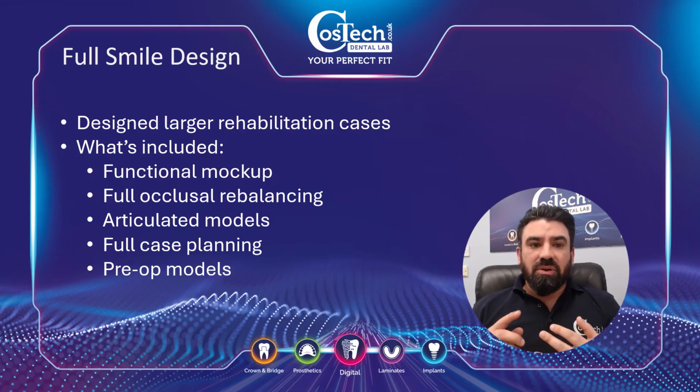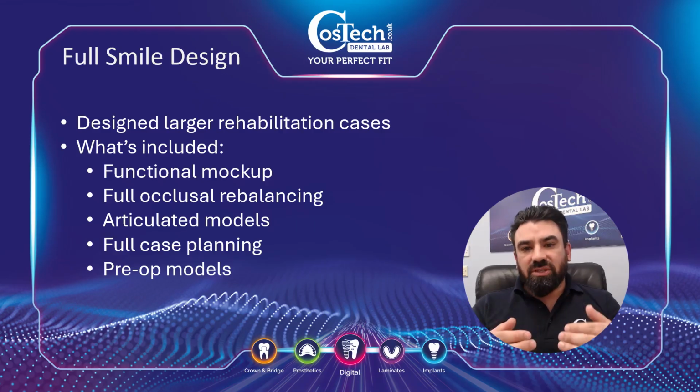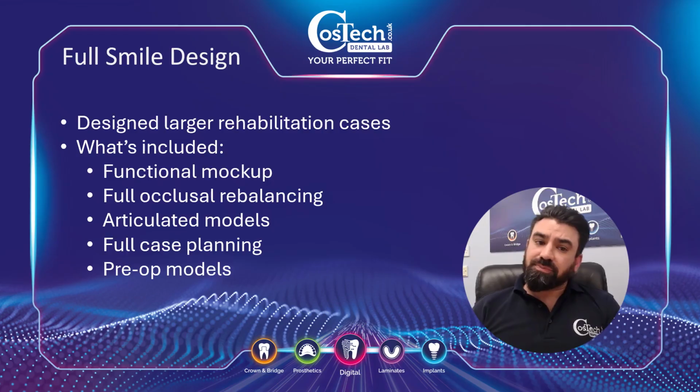But we will also do full occlusal rebalancing. This is where we work with you to say, okay, how much vertical dimension do we have to work with? What is the plan? If you say, okay, we're going to build up the posteriors to give ourselves a bit more room, we can first of all do that as the first stage, and then the second stage will come through to do the aesthetic side of things.